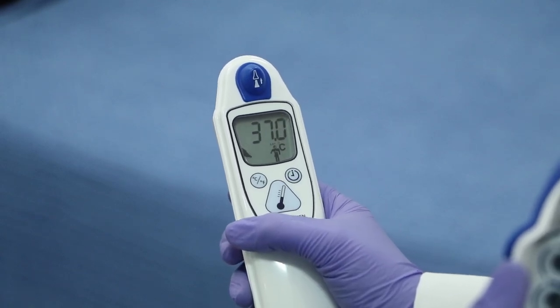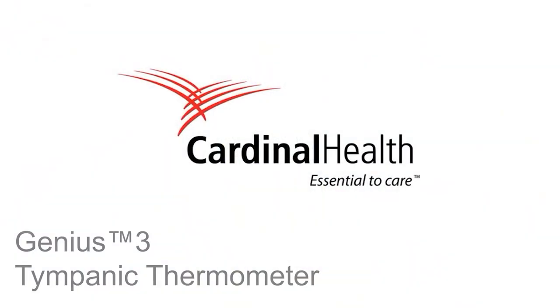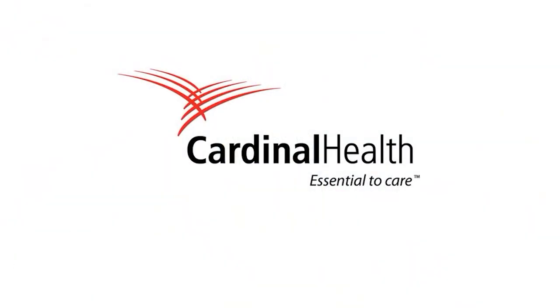This will take approximately three seconds. For more information on product availability, please contact your local Cardinal Health representative.